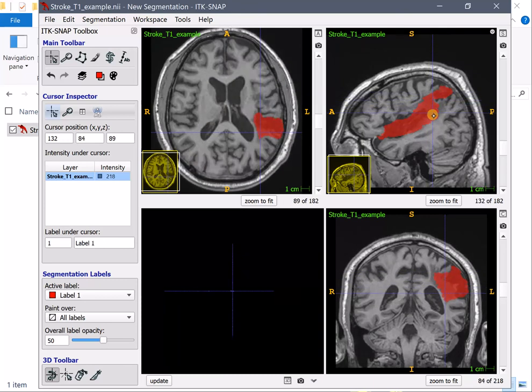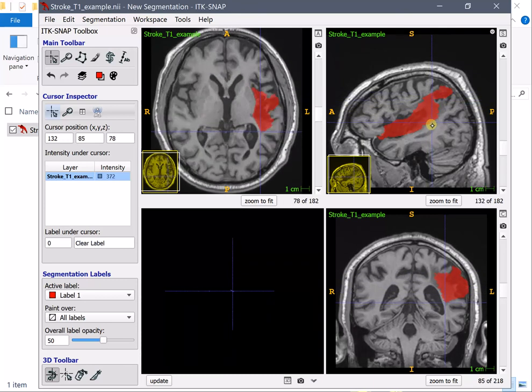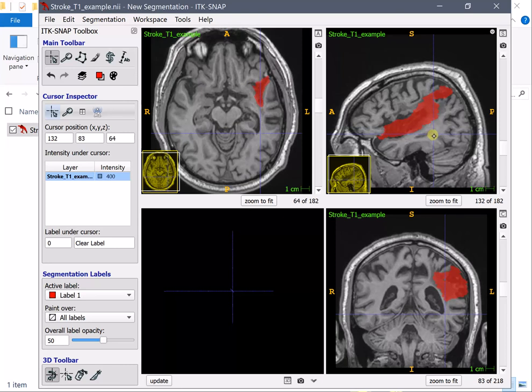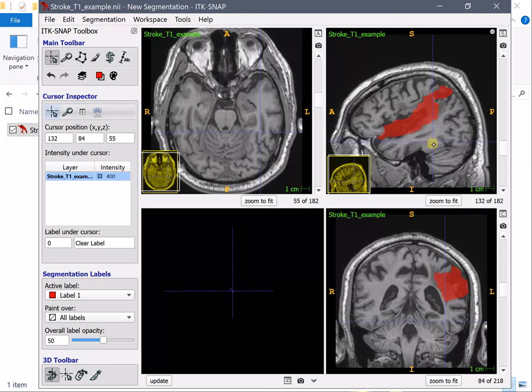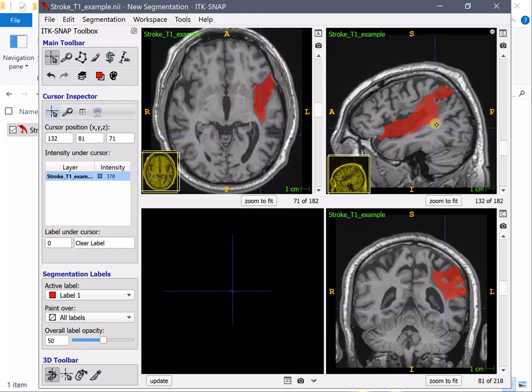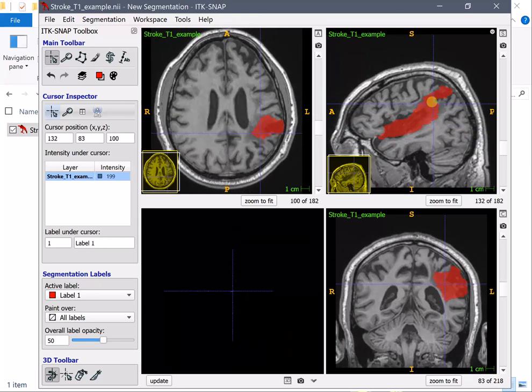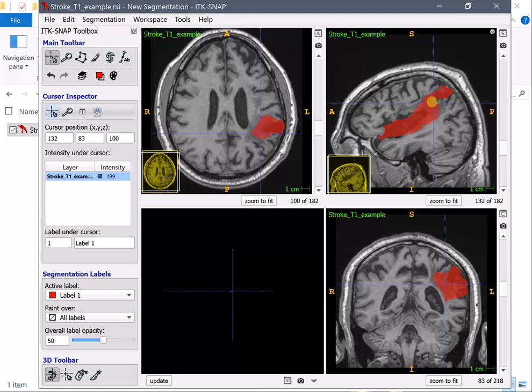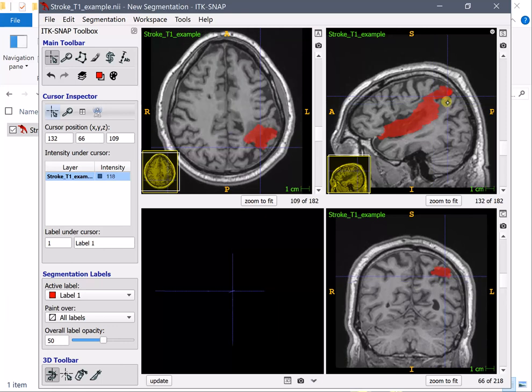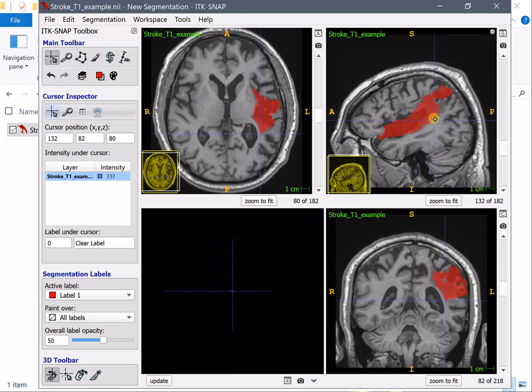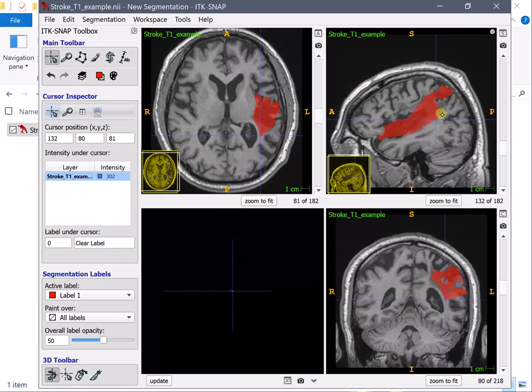For created with the lesion interpolation with the I'm sorry the segmentation interpolation method in ITK snap. This is all I believe this was very fast you may spend about 10 to 20 minutes for full lesion.